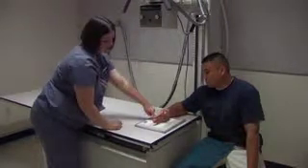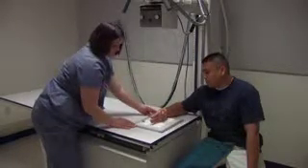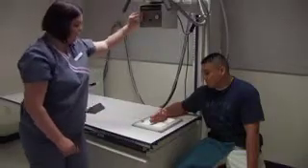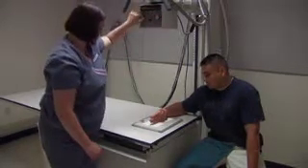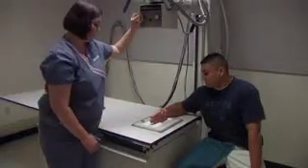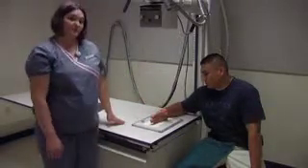So you can see our central ray is not over the metacarpals. So we're going to need to adjust that. Okay, so you want the central ray over the metacarpals. You want to get from the tips of the fingers through the carpal bones. And on a lateral projection, it's skinnier than a hand, so you can come in quite a bit without clipping the thumb. So if Ramon had his thumb out here, that would be clipping, and you would have to repeat.